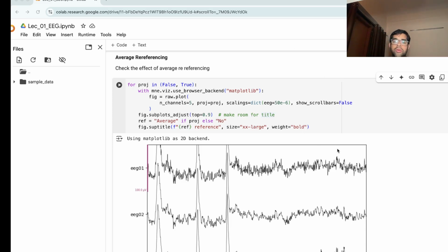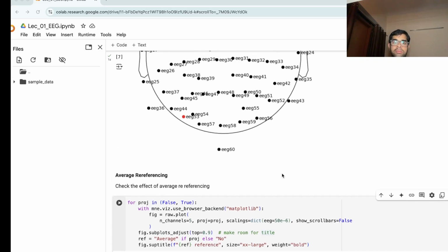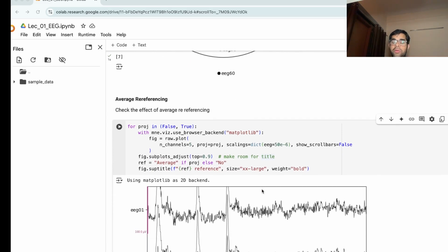Okay. So usually there are many companies which manufacture these EEG caps. In the early days, it was only the 10-20 system, but later when high density EEG and different formats came and different companies came up, they have their own system. So there is always a file associated with their locations. The EEG location file has their electrode locations and mapping, like which electrode is closest to the 10-20 system, so that they can tell which region is giving this type of signal, or some atlas where they can register or co-register the signals.